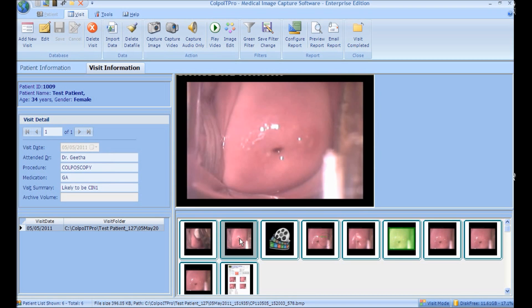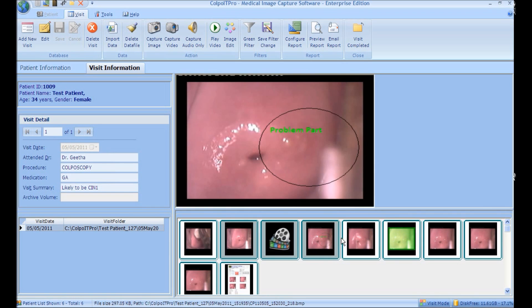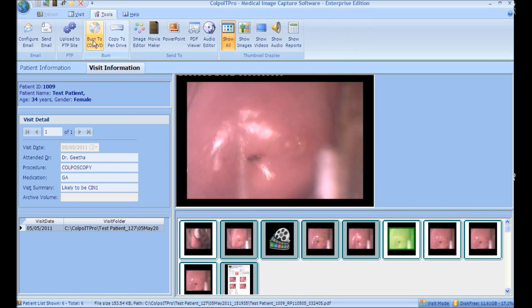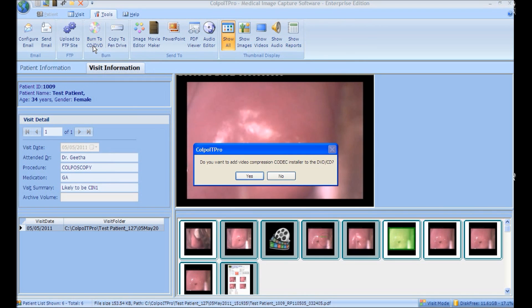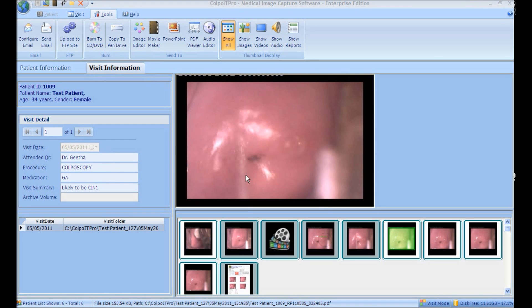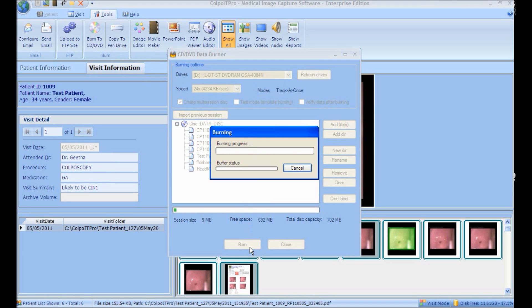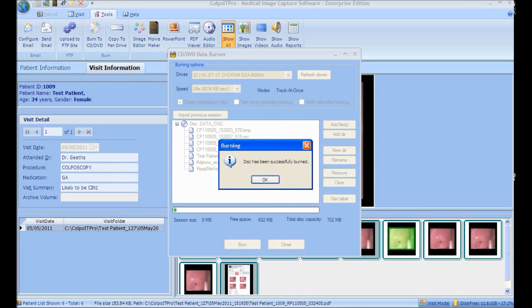Burn to CD/DVD: to burn to CD or DVD, select the data and click the respective button. Click S for the compression codec. The data is added and you can now click Burn. Please wait while burning is in progress. The disc has been successfully burnt.